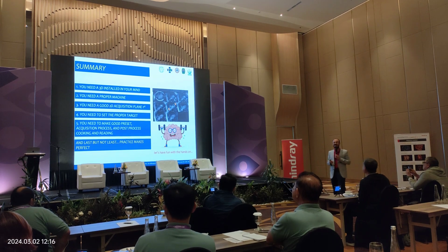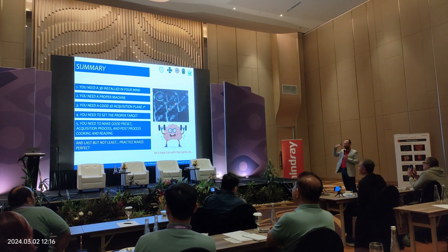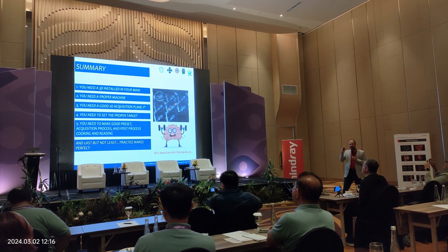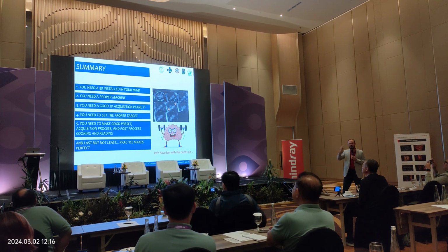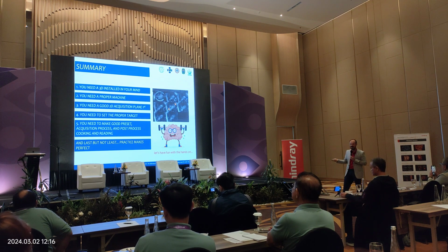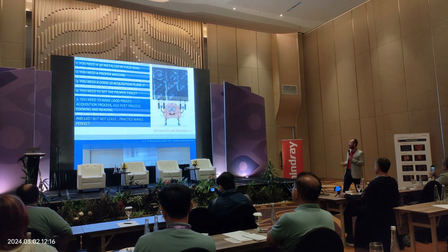For the take home message, you should hold the anatomical shape of the brain in 3 dimensions in your mind. If we want to cut it axially, mid-sagittally and coronally, what we are going to see, we have to bear in our mind, and we have to have a good machine, a proper acquisition and proper post-processing. And last but not least, practice makes perfect.